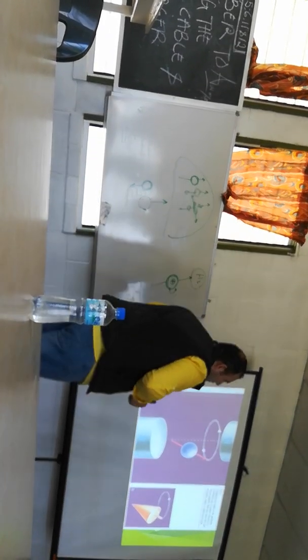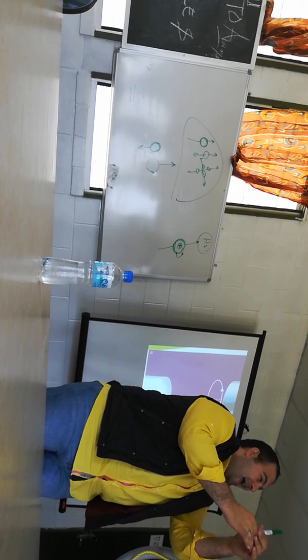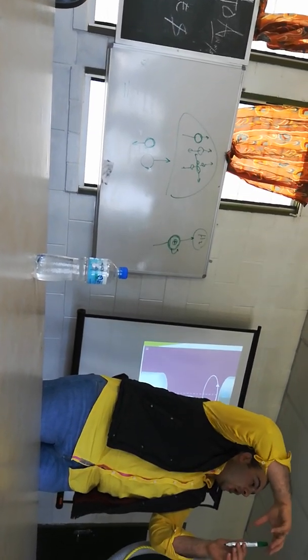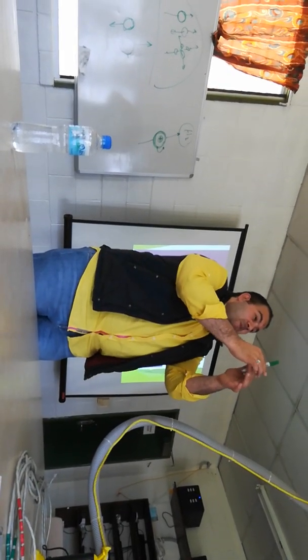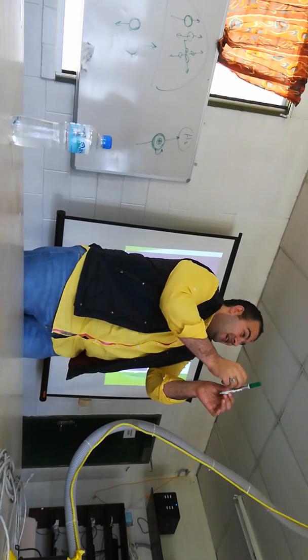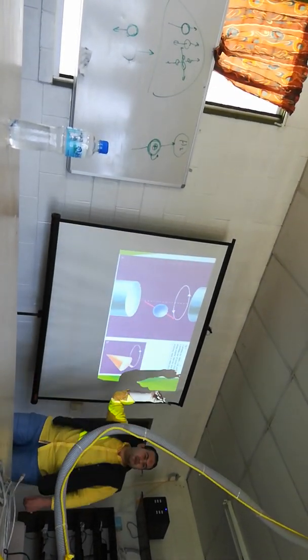And the protons moving in precession motion. I told you before that protons have spin motions, okay? And protons, after the external magnetic field, will acquire another motion. It's called precession. So at the same time, spin around its axis and moving like a wobble. Okay? Like a wobble, okay? It's moving in precession frequency, precession motion.